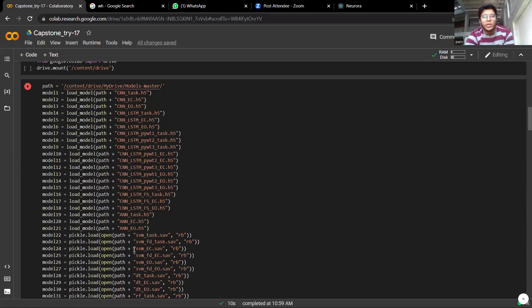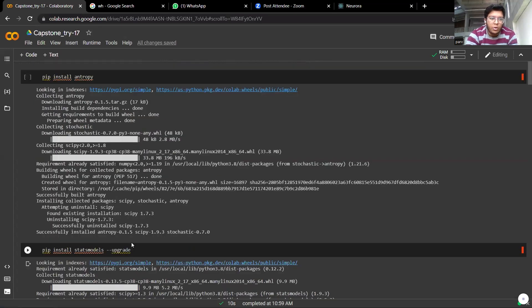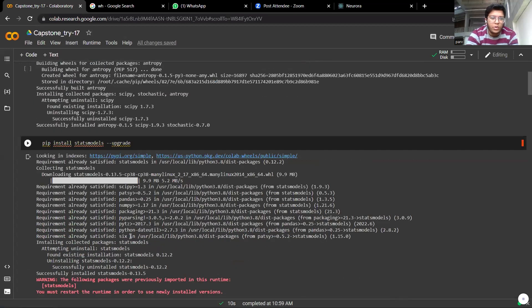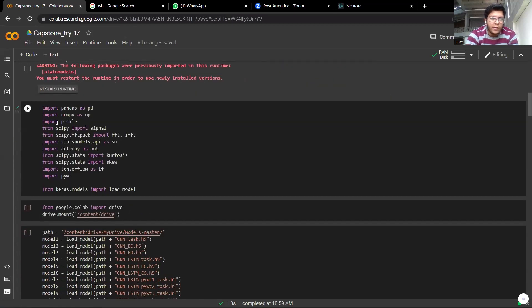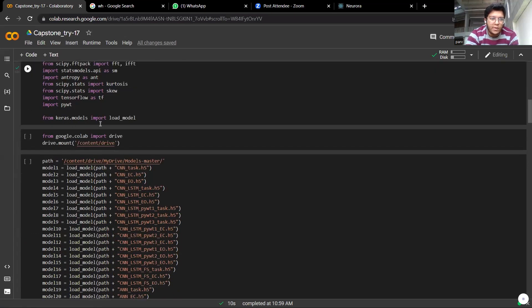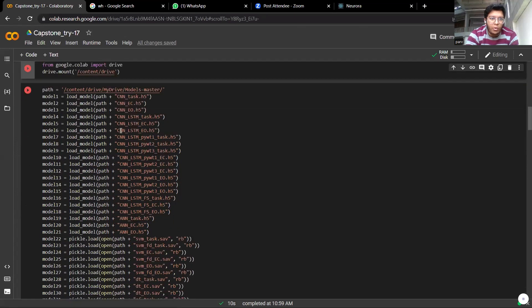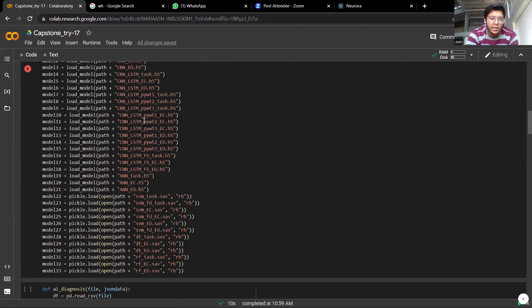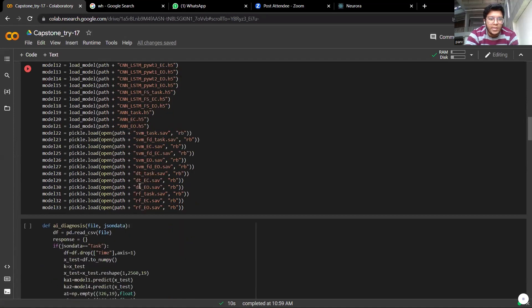So here is the Google Colab notebook that we have used to test our models. The various libraries that we have used like Pandas and NumPy, different TensorFlow as well. And here are all the models that we have used: basic CNN, CNN SVM, artificial neural network, SVM, decision tree, random forest.